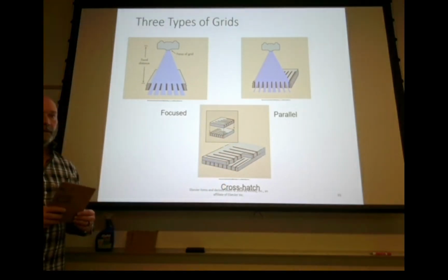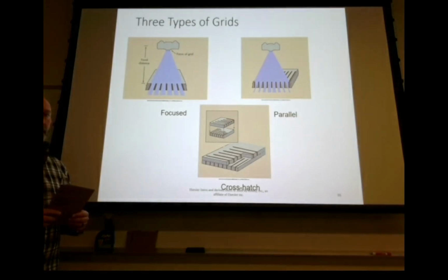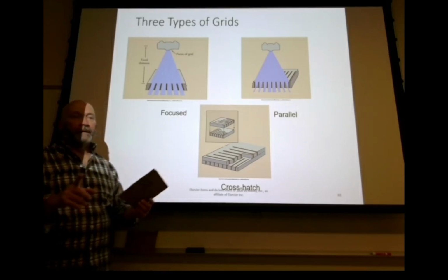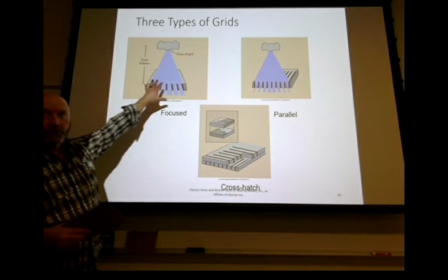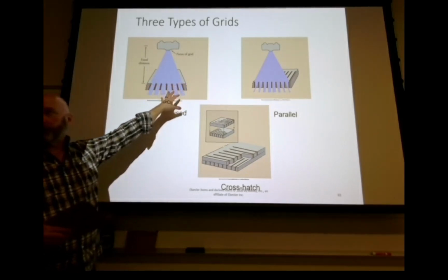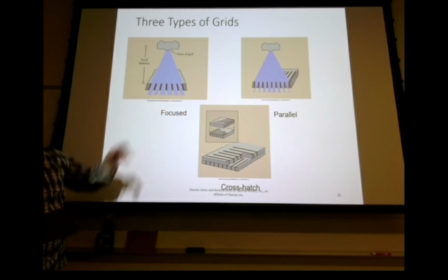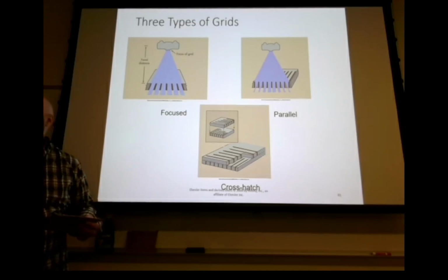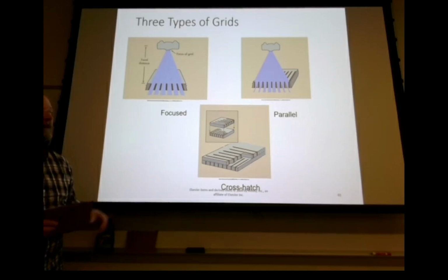Yeah, so with a focus grid, the main thing is just to have accurate SID. That's one of the things. We got a lot of different things. So most of the grids that you're going to work with are probably going to be focus grids. Okay, so if you look at the grids that you're working with in clinicals, chances are they're going to give you a focal range.